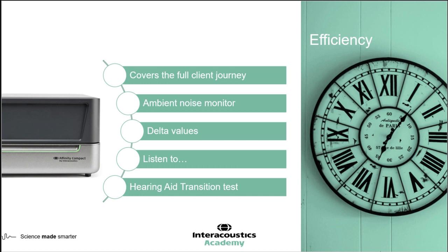I've already mentioned the listen to probe mic, listen to coupler feature. I think this has huge potential to reduce the number of follow-ups. Again, if you can get the settings right, if you can take on board the individual's feedback and concerns and comments by listening to it rather than having to rely on sometimes very vague feedback, you can hopefully improve their amplification settings in the quickest time possible, and reduce the likelihood of them having to come back again and again and again.